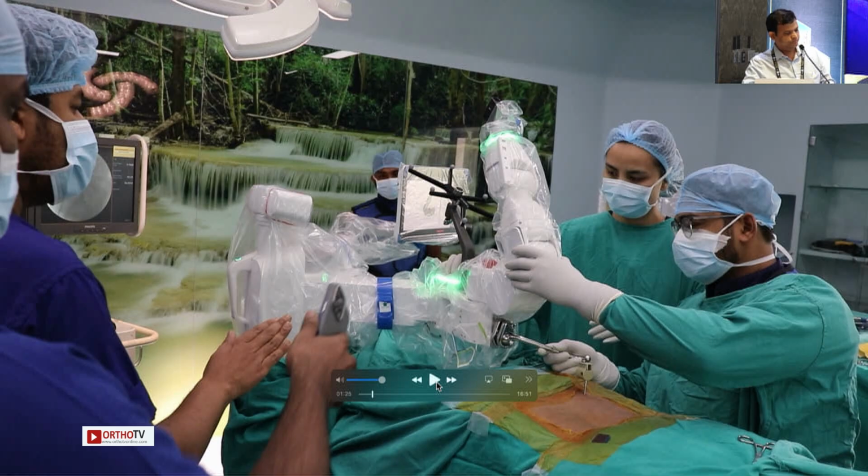But if we are using 3D navigation with a pre-op CT scan, then we just confirm it with the help of a C-arm first, and we ensure that the integrity is there. But if I'm using an intraoperative CT scan, then there is no need to check all these things, and everything is there.